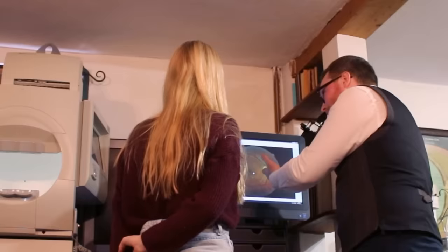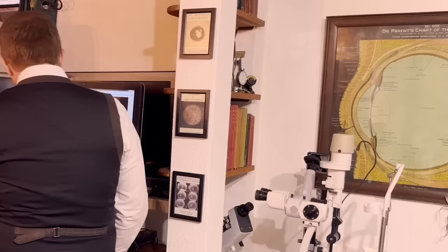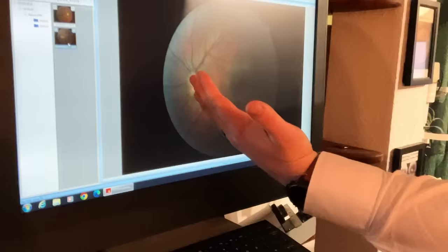And so this is your right eye, and then you'll see that your left eye is just a nice mirror image of that. So the optic nerve's over on the other side. Again, we can see the blood vessels arching up and round, and then you've got your macula again just there.